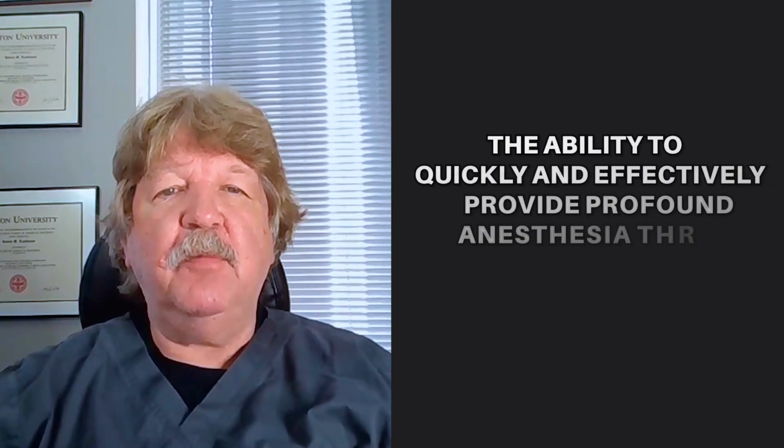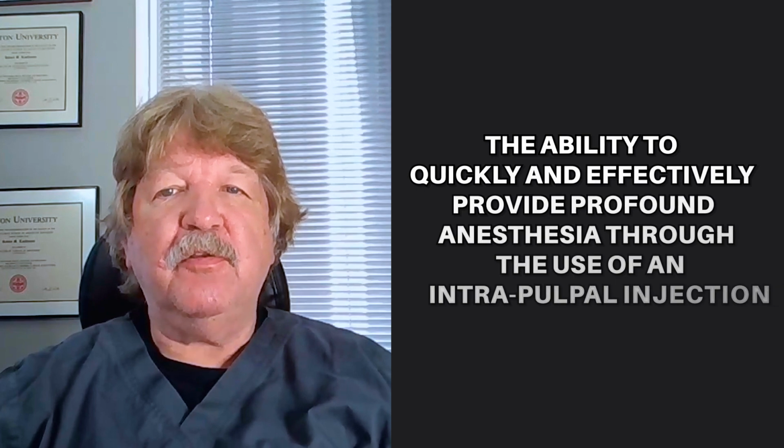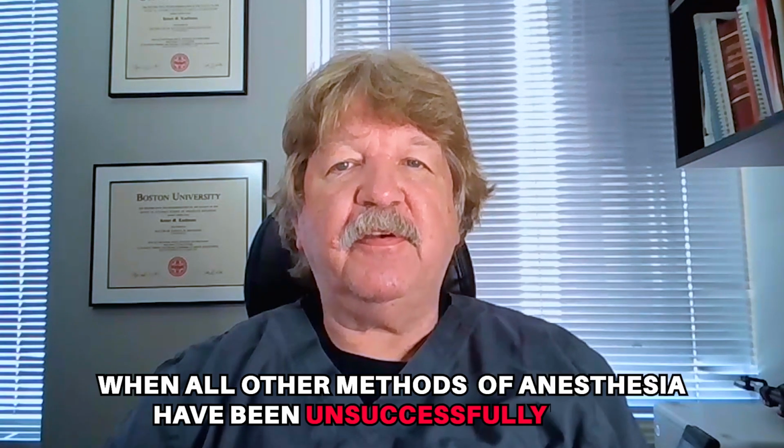One of the most useful tools of last resort in endodontic therapy is the ability to quickly and effectively provide profound anesthesia through the use of an intrapulpal injection. This method should only be used when all other methods of anesthesia have been unsuccessfully tried.